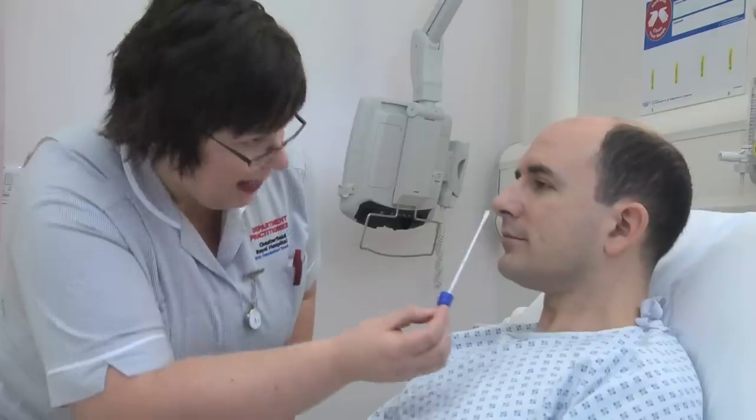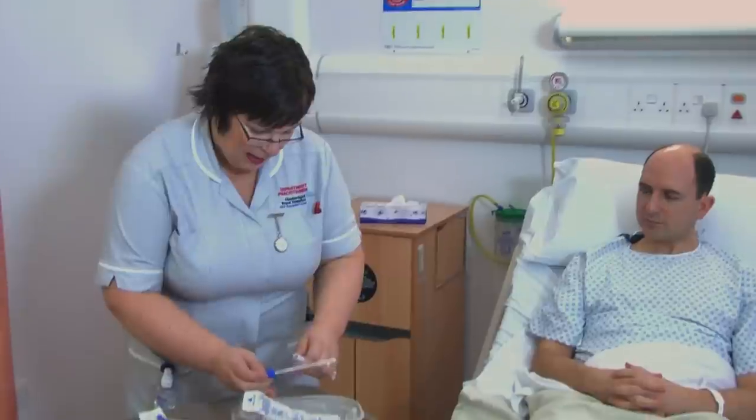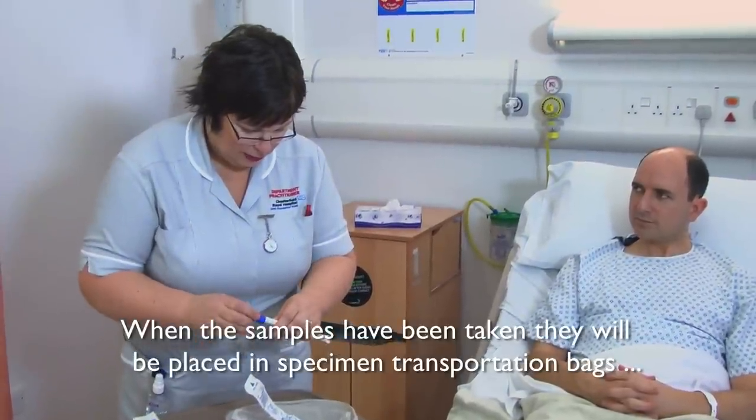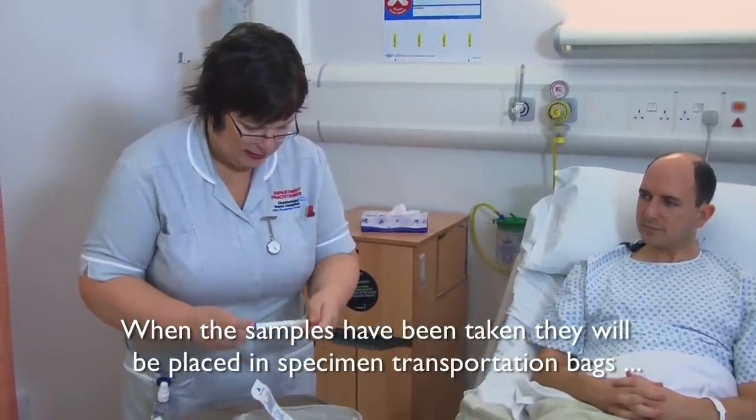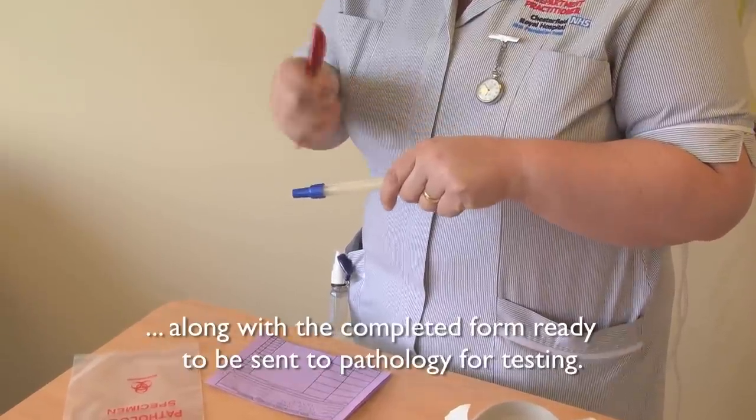And then just inside the other nostril as well. Is that all right? Yeah, that's fine. When the samples have been taken, they will be placed in a specimen transportation bag along with the completed form, ready to be sent to pathology for testing.